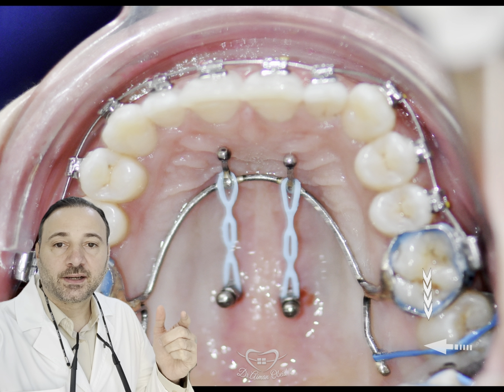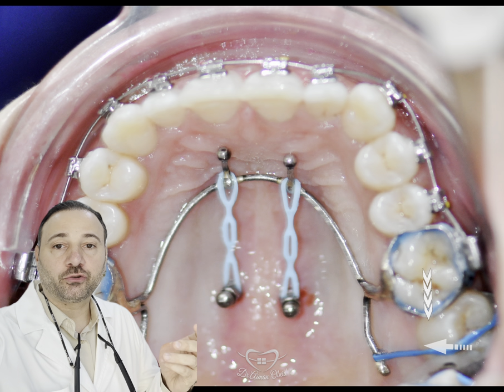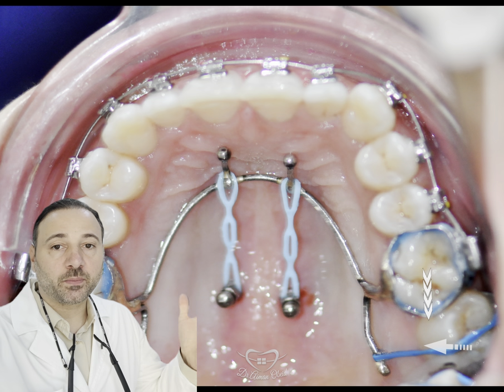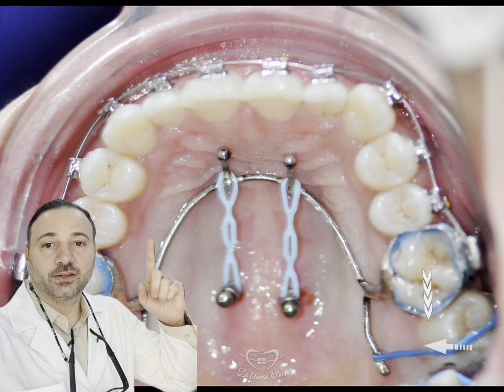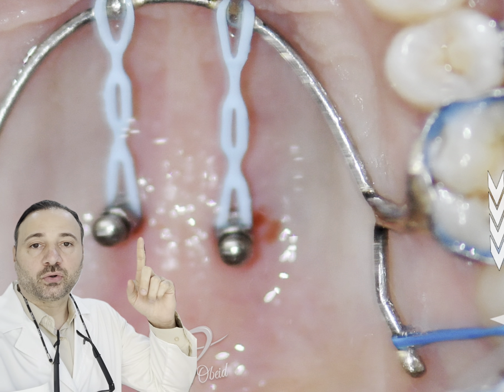Palatal TADs have a lot of uses and are easy to apply. It is a simple procedure with no pain after the anesthesia. As you can see in this photo, I have used these two palatal TADs to bring the upper teeth backward.